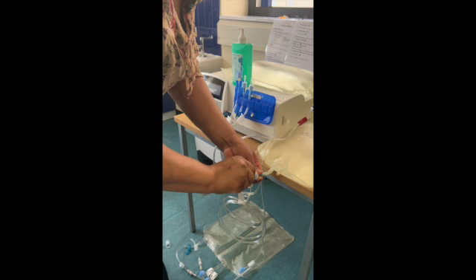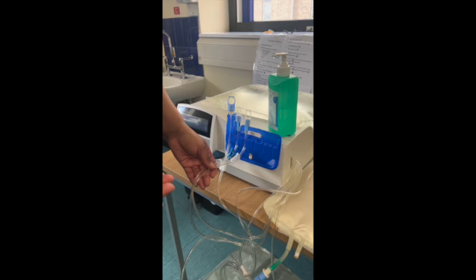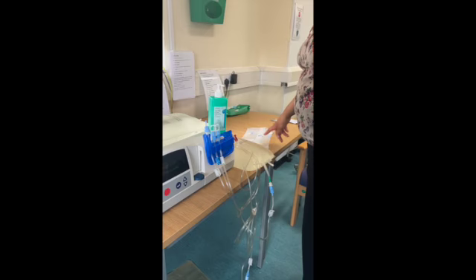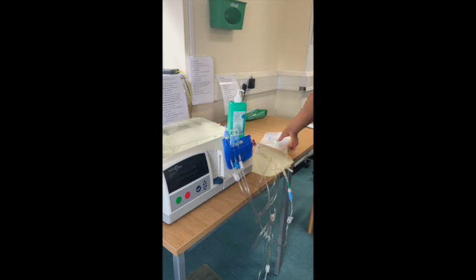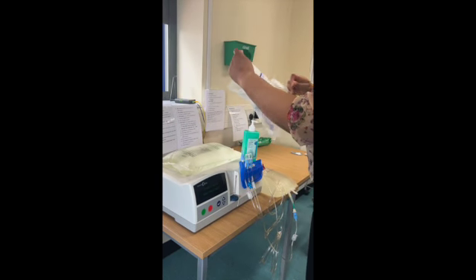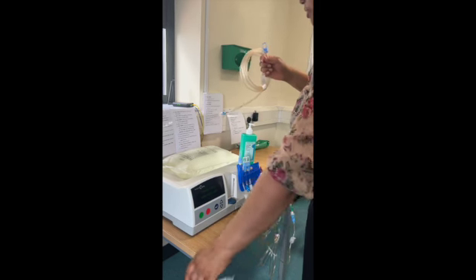And connecting it up. So these two lines are only used if I was to need additional peritoneal dialysis bags, but I don't need them, so they won't be used. I'm now going to open the extension lead bag and rest it on the machine. Again, I'm looking for the perforated edge. And again, rubbish goes straight on the floor.